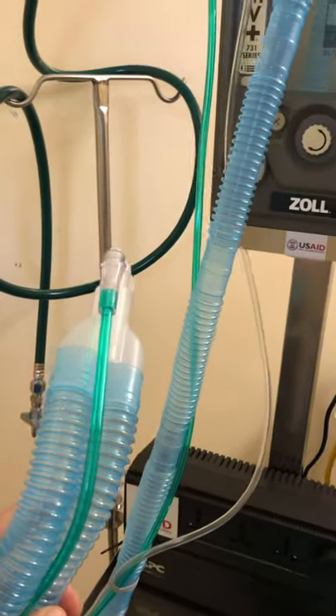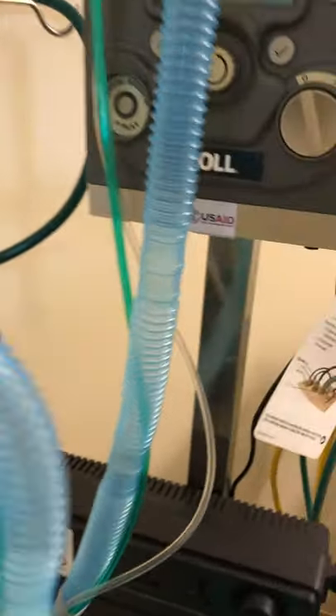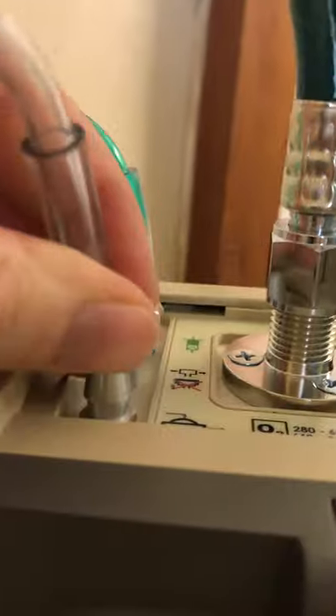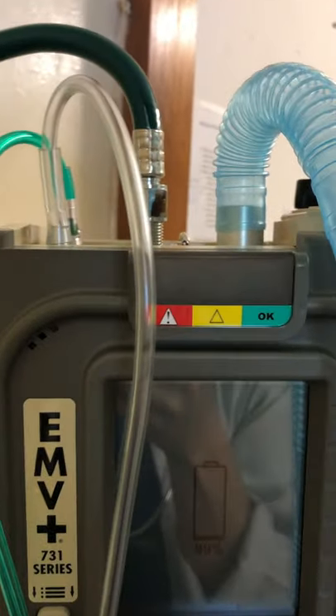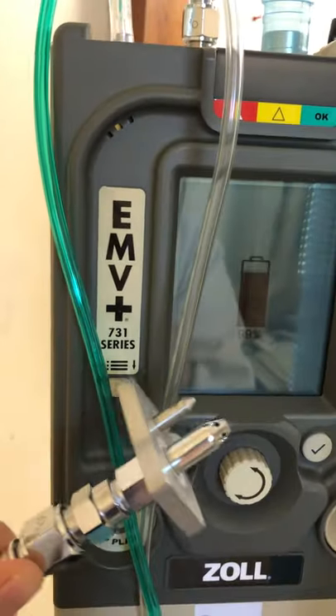There's also an extra green line and an extra white line that help control the ventilator. To plug in the tubings, look at the top of the machine — the green line plugs into the green outlet here, and the clear one plugs into the silver one. Make sure they're plugged in tightly. Then your blue one comes into the big one. Also on top of the machine, we have our high pressure oxygen tubing that we can plug into the wall like we're used to.